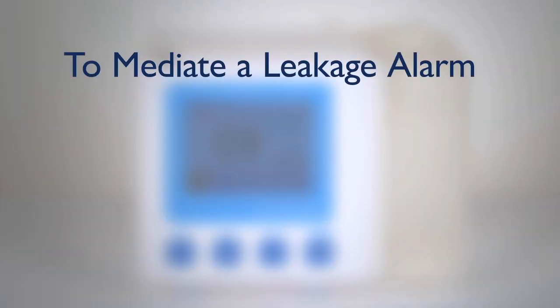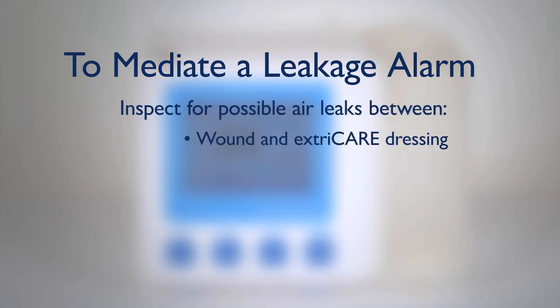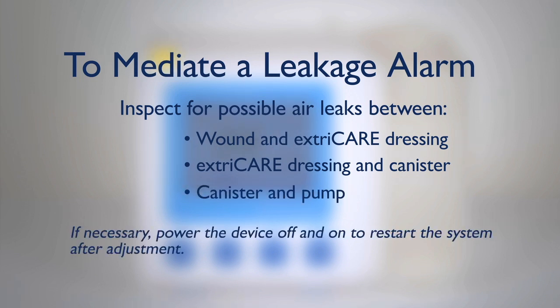To mediate a leakage alarm, inspect for possible air leaks between the wound and the ExtraCare dressing, the ExtraCare dressing and canister, and the canister and pump. If necessary, power the device off and on to restart the system after adjustment.